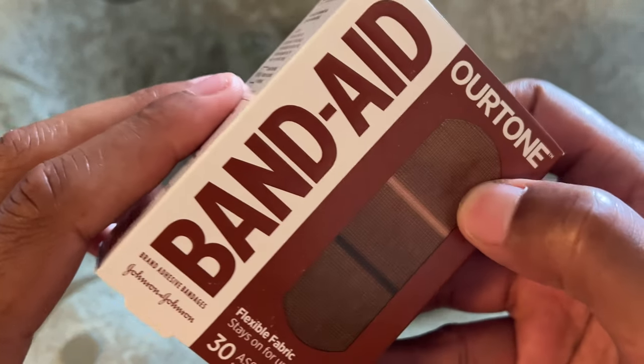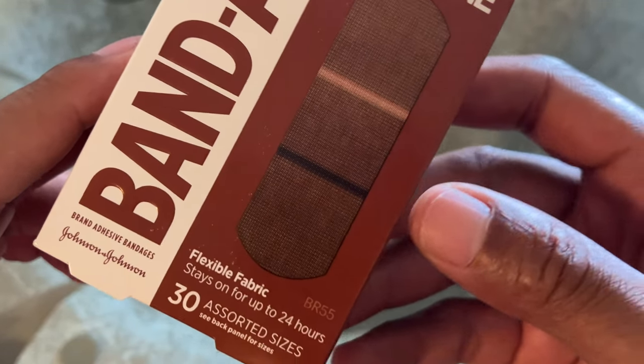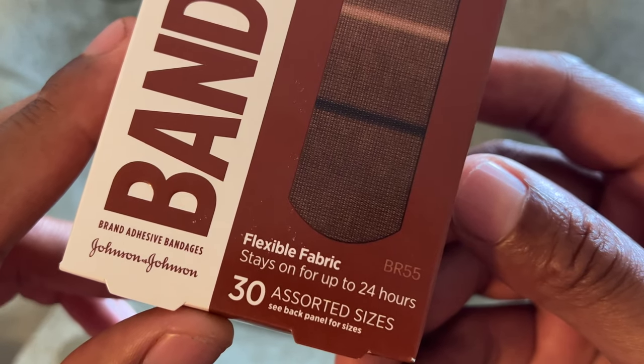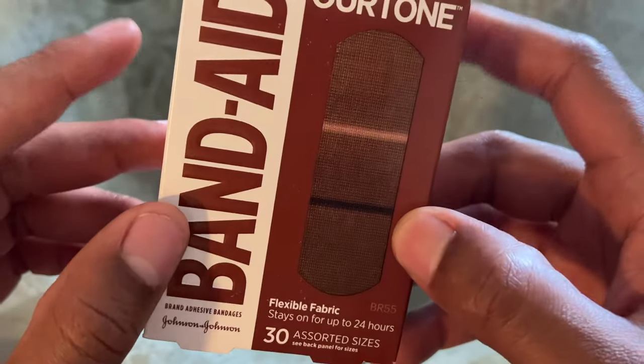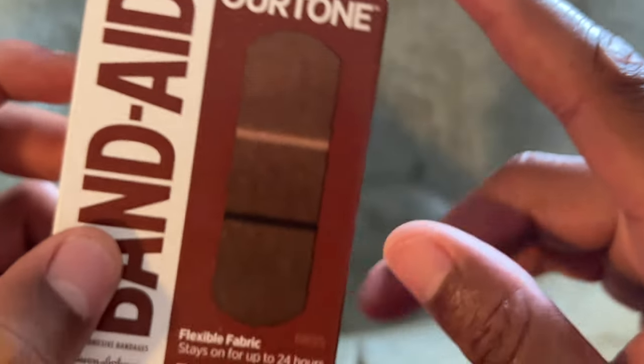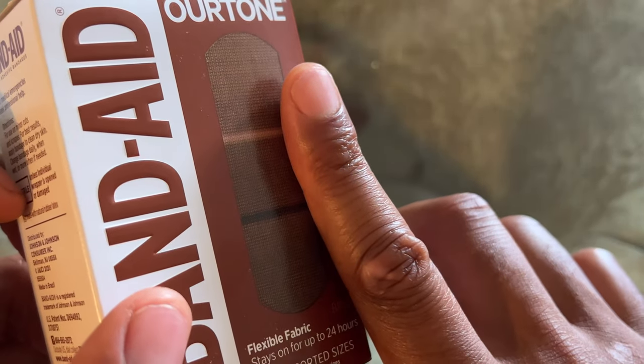I have Band-Aid Our Tone Flexible Fabric Band-Aids. It stays on for up to 24 hours. I'm excited to try these on — these are Our Tone. See if that matches my tone close enough.